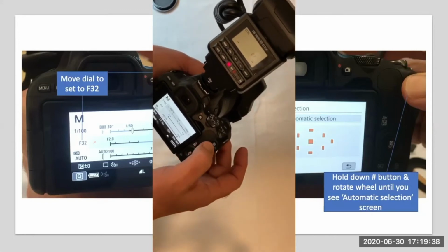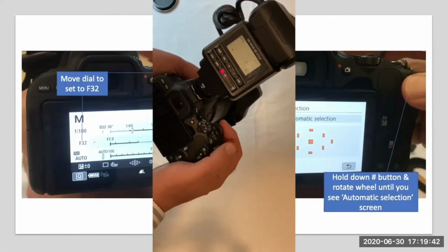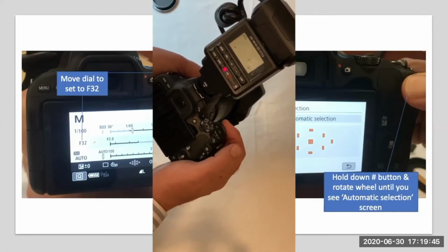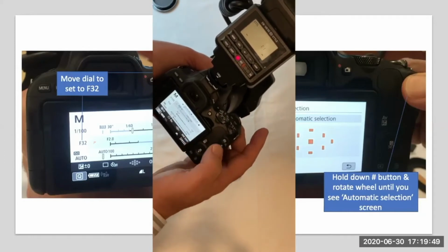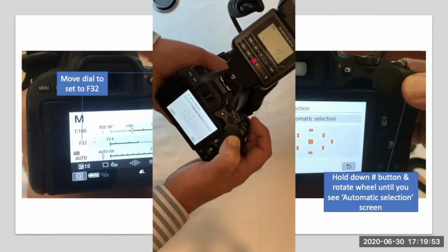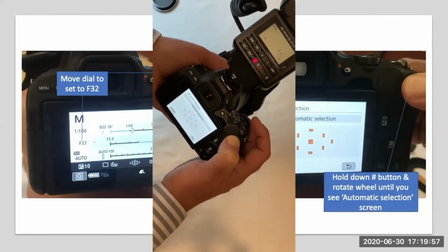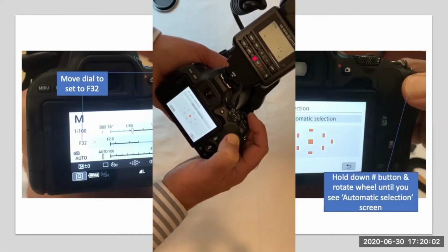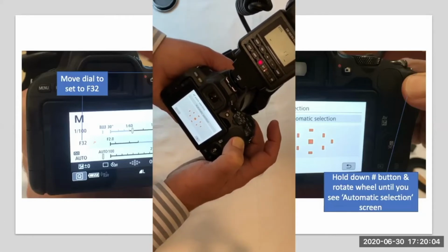So if you hold down that little button, which looks like four little dots in a cross, press the button, press the shutter halfway, and you should get the back lighting up. Press that in, and you can have the difference between automatic selection and manual selection in all the different areas that the camera's seeing. You could even have it in the center or back to automatic selection. Probably best to leave it at automatic selection.